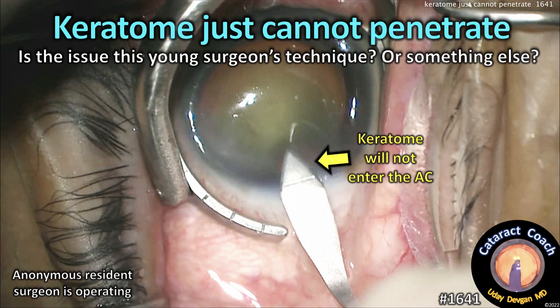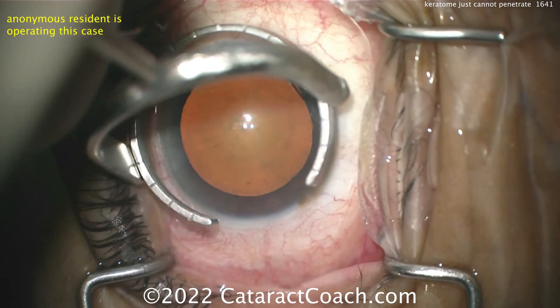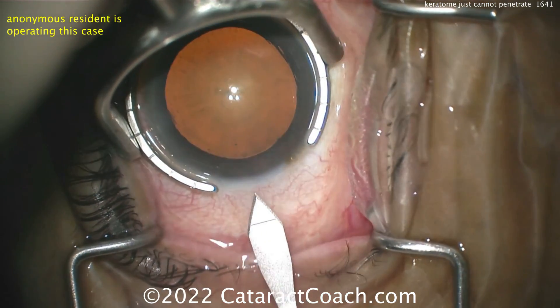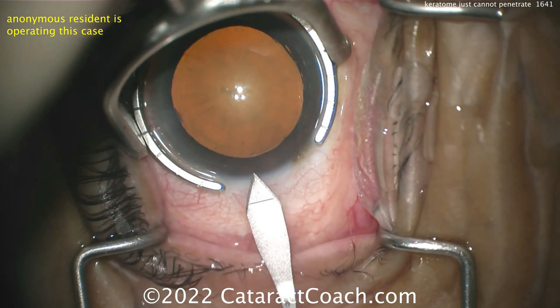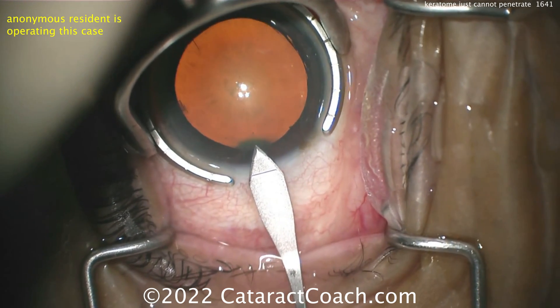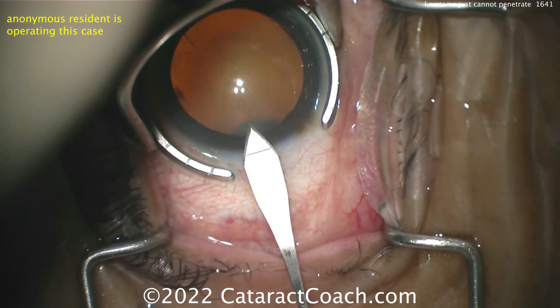This keratome just cannot penetrate. Is the issue the young surgeon's technique, or something else? This is an anonymous resident who's operating this case. This resident has some experience but not a tremendous amount. You can see the draping looks good, the eye is in primary, fixation ring looks nicely centered, and here comes the keratome starting to enter, making a reasonable tunnel length.